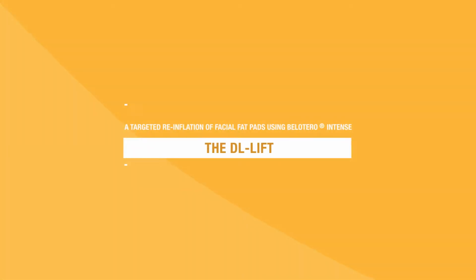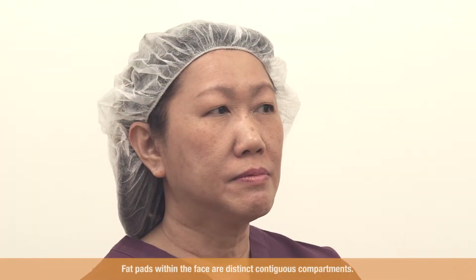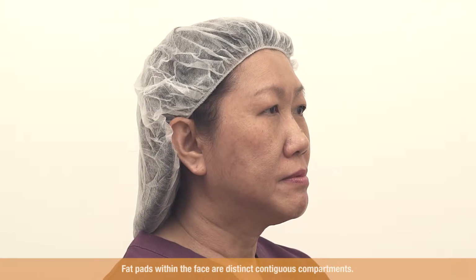The DL Lift, a targeted reinflation of facial fat pads using Belotero Intense. Fat pads within the face are distinct contiguous compartments, with their fibrous walls contributing to the superficial muscular aponeurotic system, or the SMAS. The lateral compartments are less mobile, being more deeply fixated than the medial compartments. Atrophy of the lateral fat pads can manifest as ptosis of medial fat pads, commonly referred to as the jowls.